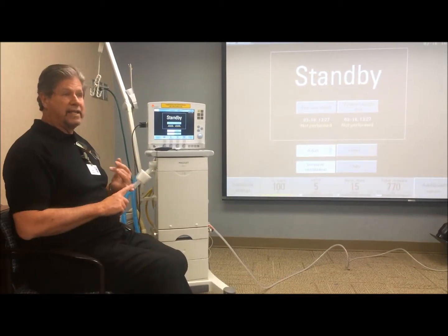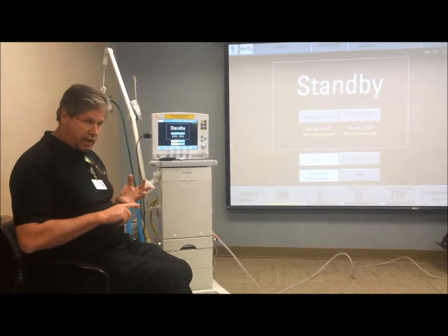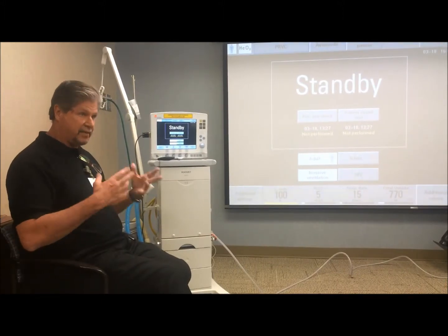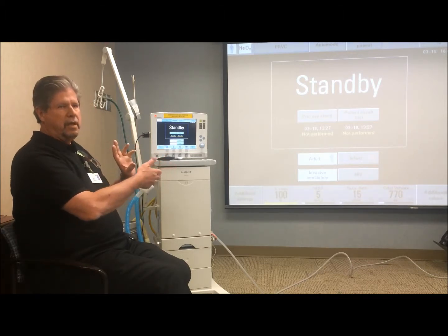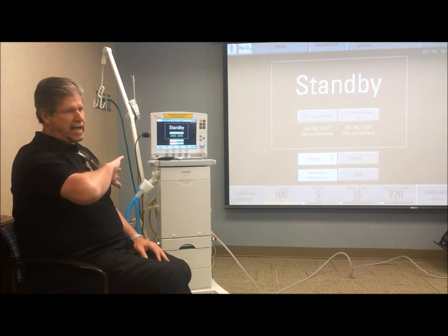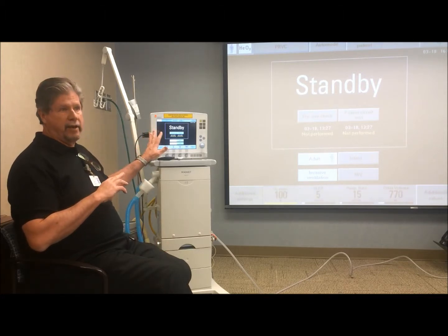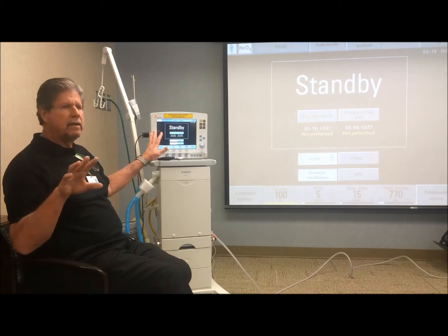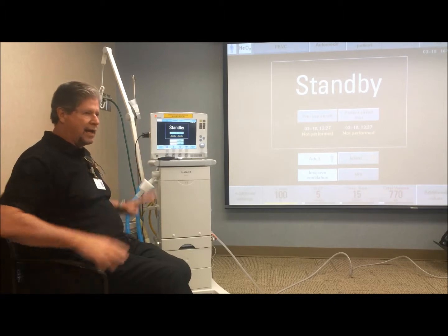to talk about non-invasive application for NICU patients, right? How non-invasive works, and also how this mini-flow works. But some people have been confused. In the talk I had yesterday, some people were thinking mini-flow is like a mode or a feature on the ventilator. Is anybody thinking that? No? That they know that mini-flow is the apparatus?